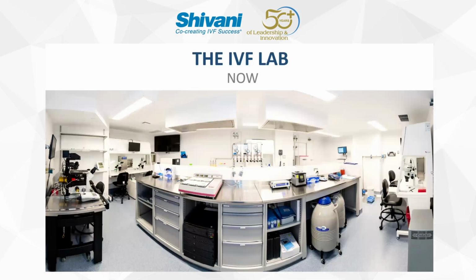This is just a representative example of a modern IVF lab in the States, covering many of the things that we've already talked about here: the vinyl flooring, low VOC adhesives, solid surface stainless steel, powder coated metal cabinetry, IVF specific supplies. You can see in this particular lab dedicated centralized HVAC with those diffusers up top, and this workflow optimized layout around a central working unit with ICSI stations and workstations spread out to avoid any bottlenecks. Thinking through that process, you can even see some of the nice centralized gas manifolds there. Many of these considerations are based on trying to maintain good air quality, and we'll talk about some of those points now.